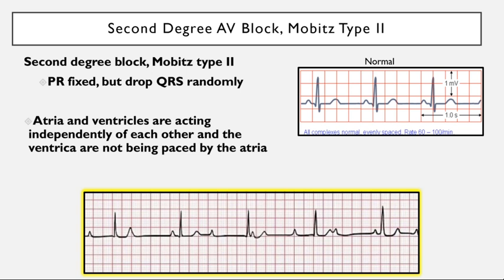As far as seeing these things, I would just look for a small wave, big QRS complex, and then another smaller wave, at least for testing purposes. Don't get tripped up by the distances between these things because these are very inconsistent. But you can see here that there needs to be 2 waves in between QRS complexes, 2, 2, and here's 3, right? And here's 3. Okay. So that's what I would look for in this.